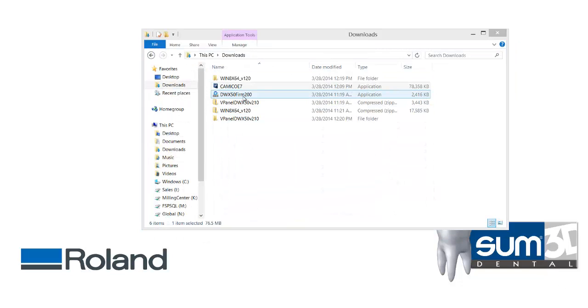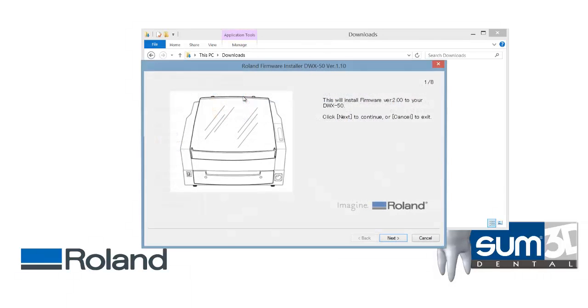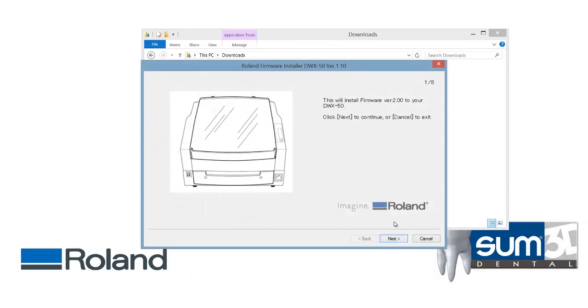Next you would install the firmware. Since I currently have the most up-to-date firmware, this installer won't do anything for me. But if you double click it, the on-screen instructions will walk you through how to update the firmware.